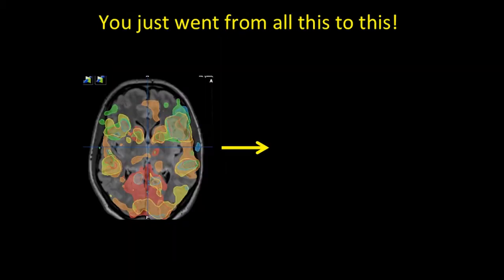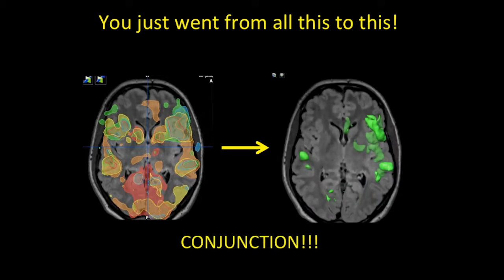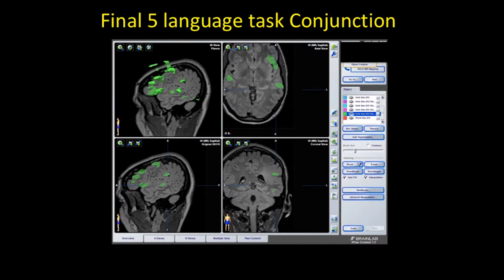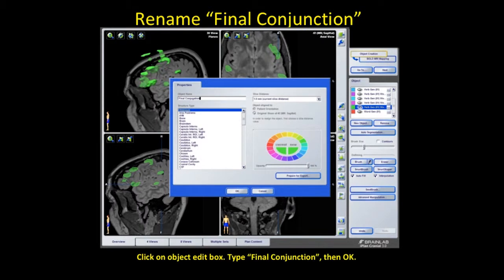We just went from all five language tasks overlapping to, with our conjunction analysis, intersection, and advanced manipulation in Brain Lab, only the areas that are essential or common to all those language tasks. You can easily see that this patient with a left cortical dysplasia of the Perisylvian-Wernicke area is definitely left language dominant. This is our final five-language-task conjunction 3D object in green. Rename it — click open edit box, type in 'final conjunction,' and hit OK.